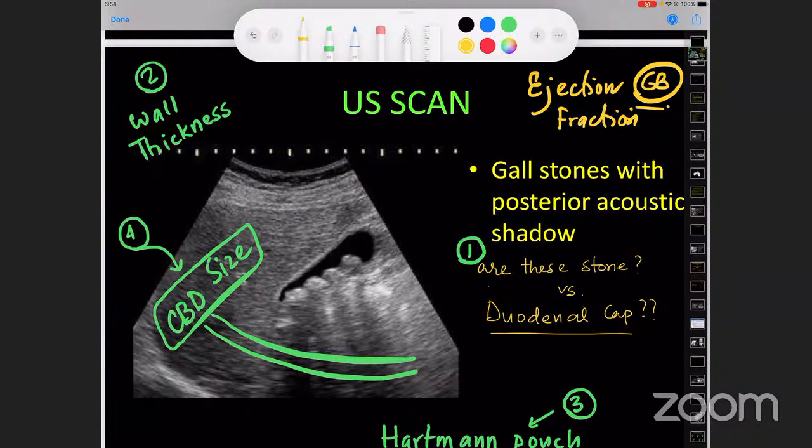And sir, on ultrasonography, we can do a fasting scan, and then ask the patient to take a normal meal, and after half an hour to 45 minutes, we can recheck the gallbladder to see the contraction. Right. Okay.